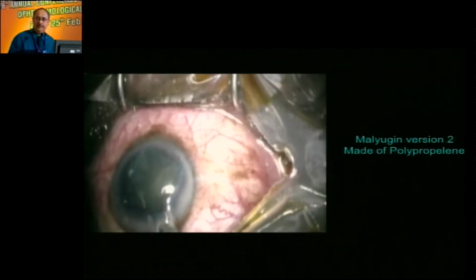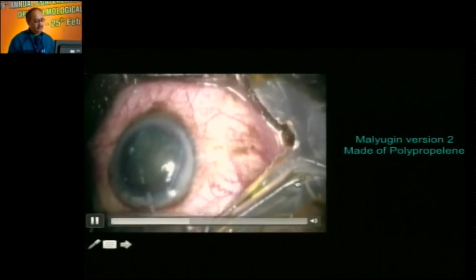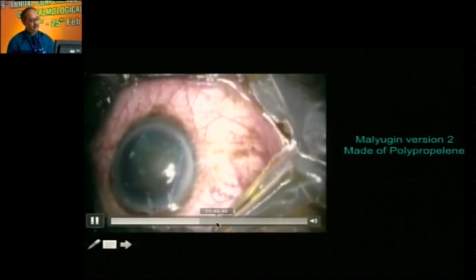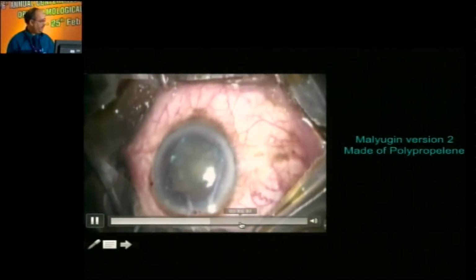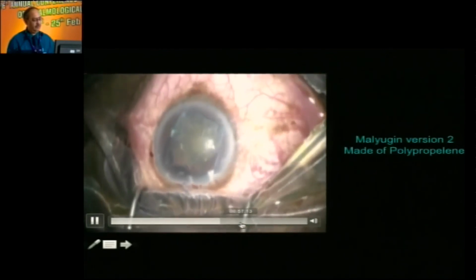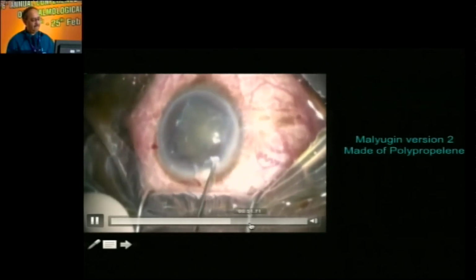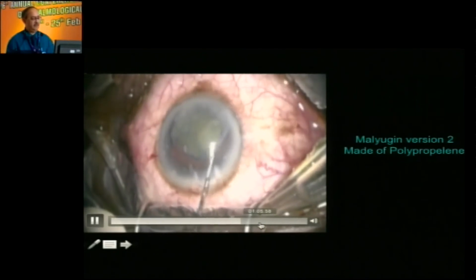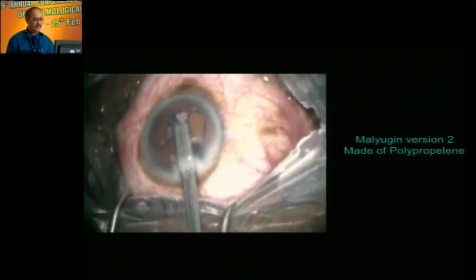Most of the pupil expanders are coming up now with injectors, and the theme is that you make it predictable insertion and predictable outcome. I still have 1 minute. Yeah. So you have seen this is 4 quadrantic, and you can take it out.